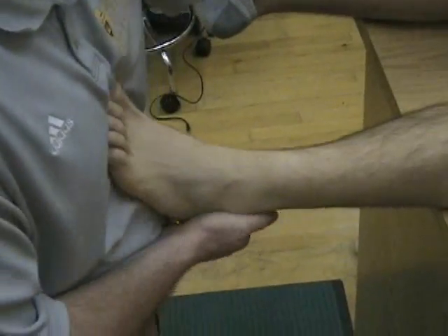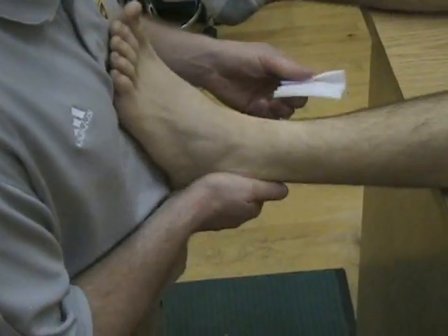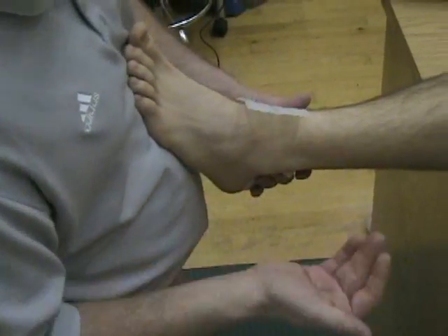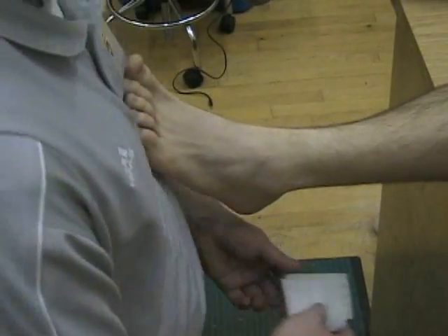Now we're going to go over the taping of the ankle and certain components you need to have. First we're going to start off with heel and lace pads, put some goo on there to prevent some friction and blisters. I'm not going to do that for now.